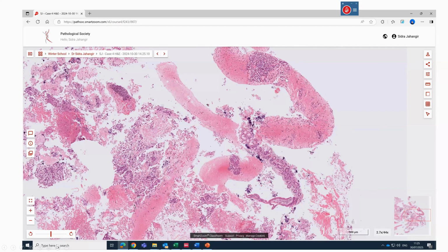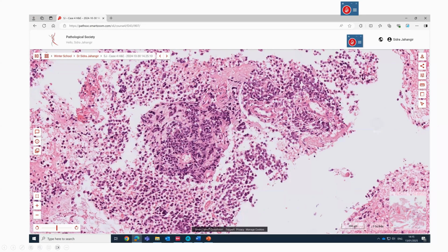So there are some tumor cells here, again blood, some tumor cells here, some organoid patterns, and most of the tumor looks discohesive. Further high power: you have a vessel and the tumor cells are arranged around this vessel, forming some papillary arrangement. Again discohesive cells, maybe some necrosis, some tubular arrangement, and again tumor cells here and there.